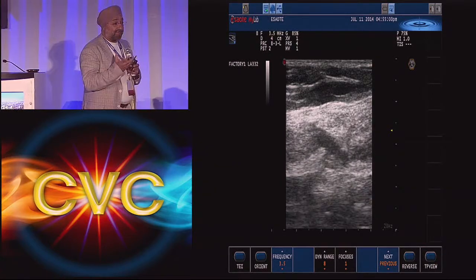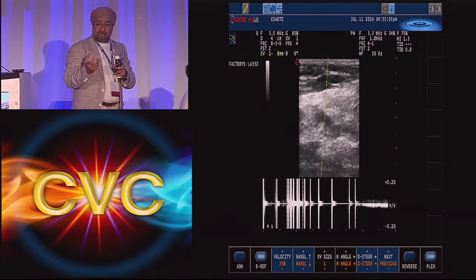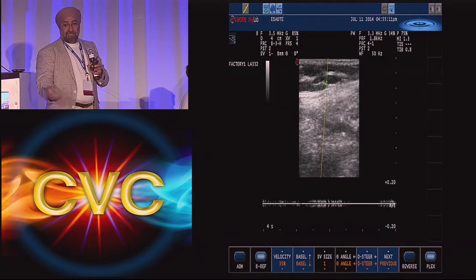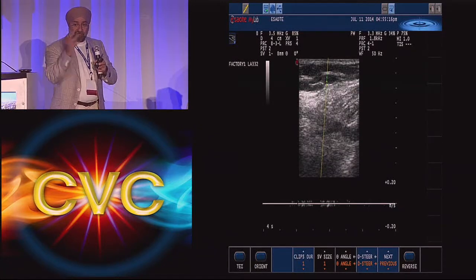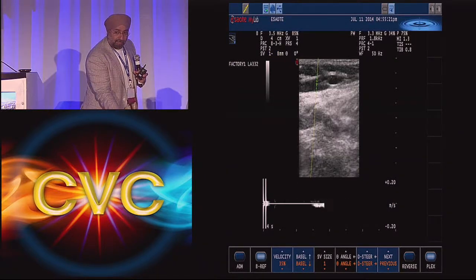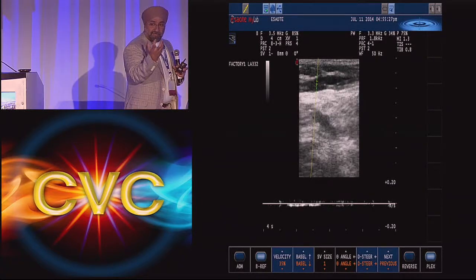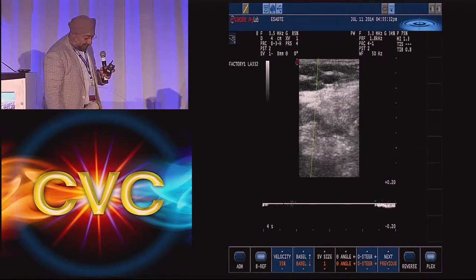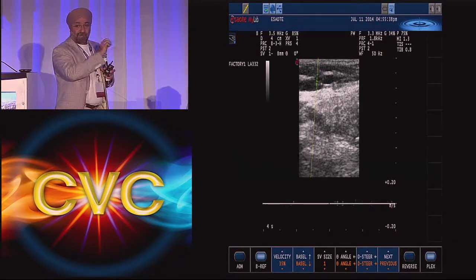And if you're in the calf, especially in a normal one, we can look at that. You'll see venous lakes, and then as they contract the calves, you'll see the venous lakes kind of empty out. So that's how the pump works. When you're standing, as I'm standing now, those venous lakes are just filling up with blood. As I lift forward and put my foot down, my plantar surface just emptied. And then as I lift it up and squeeze my calf muscles, those venous lakes just squish up. When I do this, it acts like a piston and pushes whatever else is there up. That's your normal calf pump.